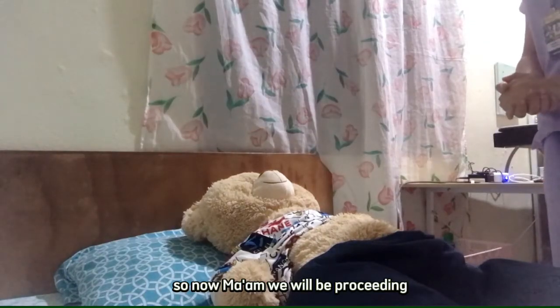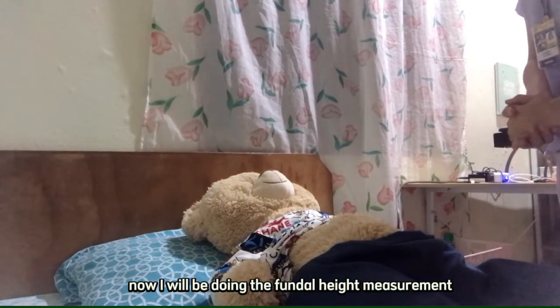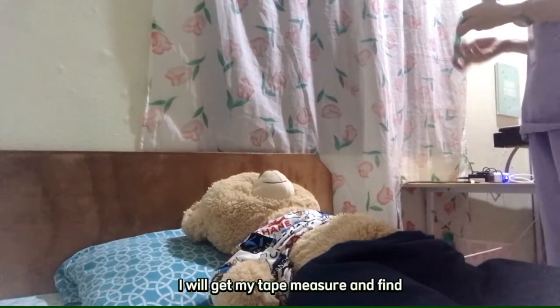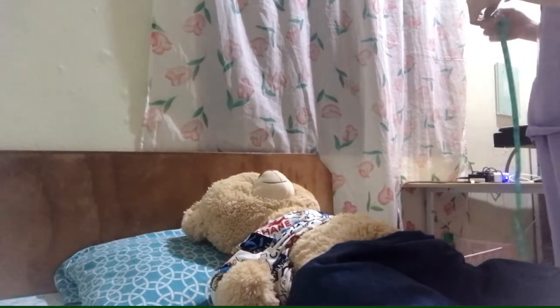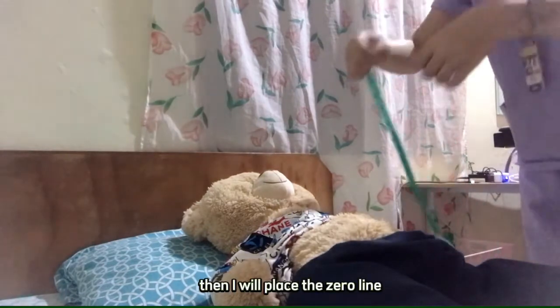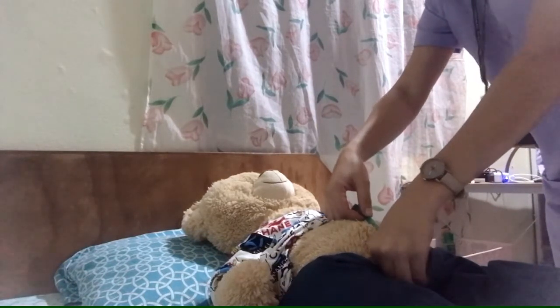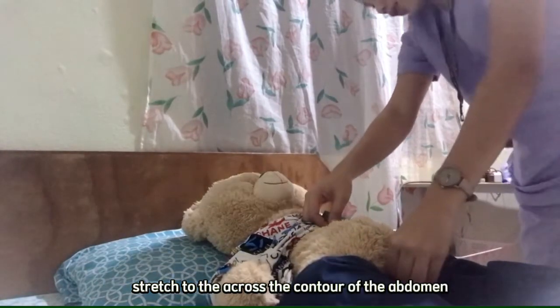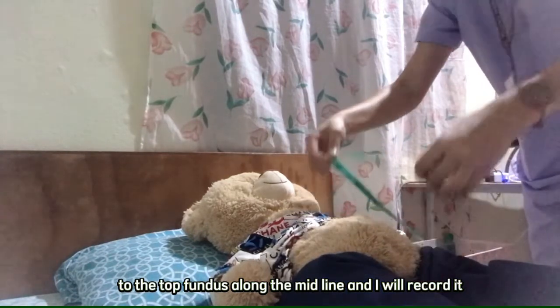So now, ma'am, we will be proceeding to the measurement of fundal height. I will get my tape measure and find the zero line on it. Then, I will place the zero line of the tape measure at the superior border of the symphysis pubis, stretch it across the contour of the abdomen to the top of the fundus along the midline, and I will record it.